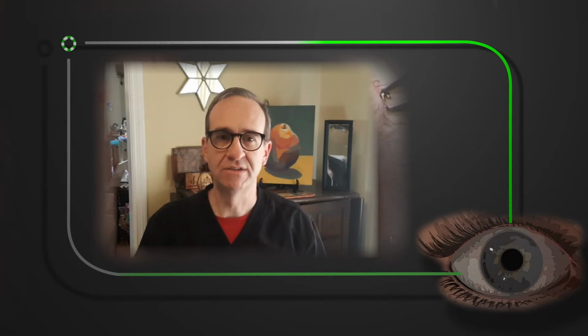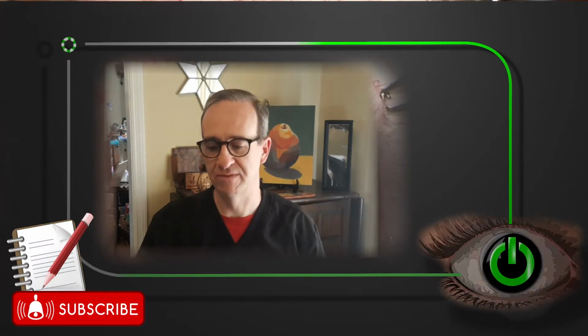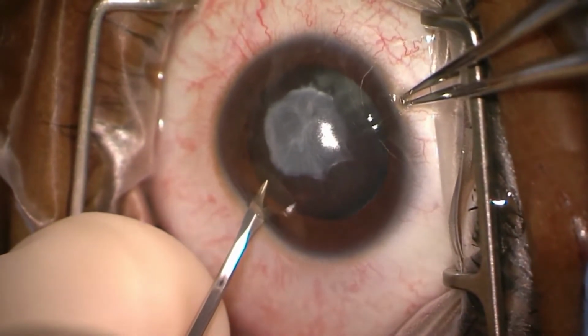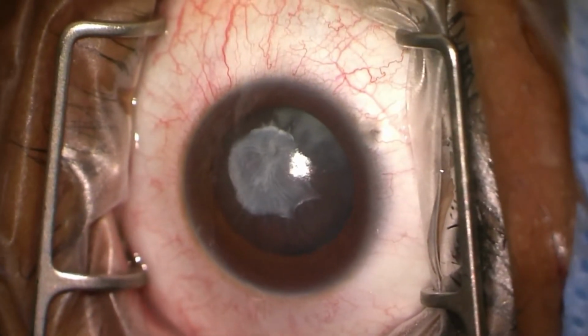And so I want to show you some of those steps as we go through this, and hopefully it will be useful in your career. So I'm going to go ahead and put the paracentesis in, and then we're going to go ahead and stop this surgery, or at least stop the video of the surgery, and then we need to talk a little bit.